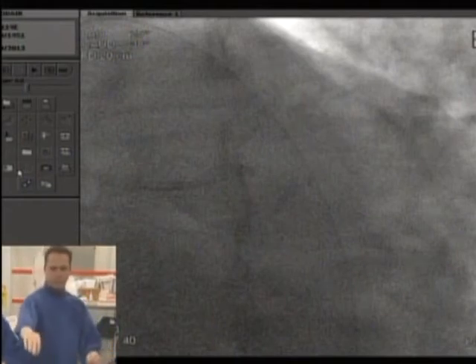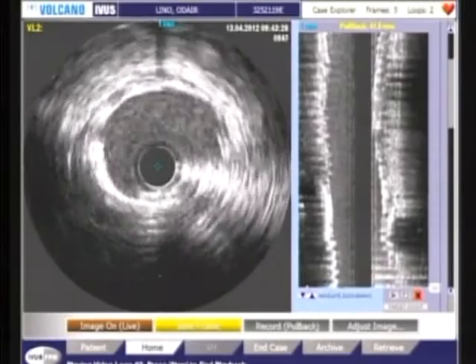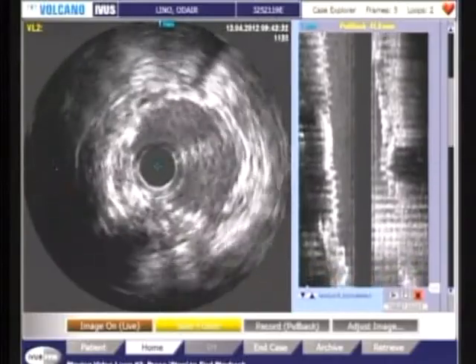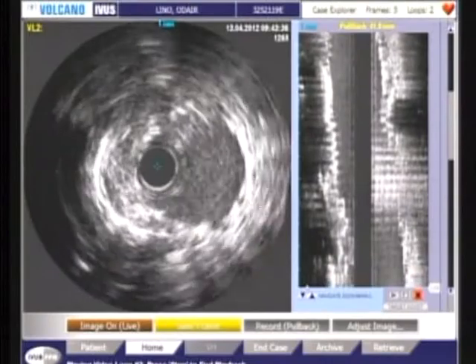How can we recognize the development of this restenosis? I mean, it may not contribute to the... Here we go. Yeah, I think this is a very good comment. Maybe it's just progression in other sites that cause the angina and not the stent restenosis itself. But let's see what Pedro has to say about the IVUS.